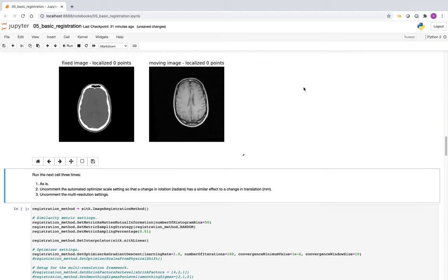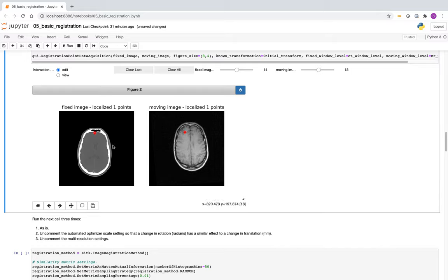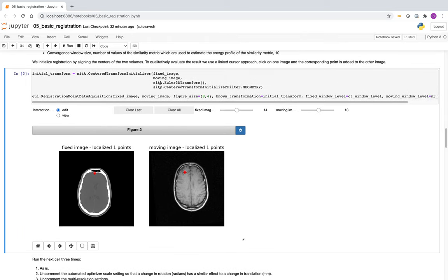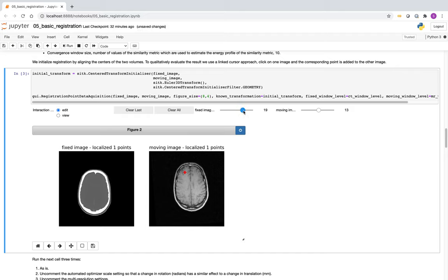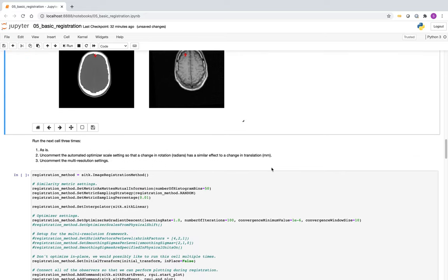This UI allows us to add points that are mapped to the other image using the known transformation — in this case the center transform initializer, which aligns the two centers of the volumes. Obviously the anatomy is not aligned. We can scroll to another point, add it, and see where it maps to on the other volume. These are clearly not aligned, and we would like to align them.